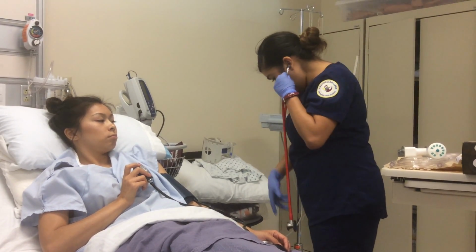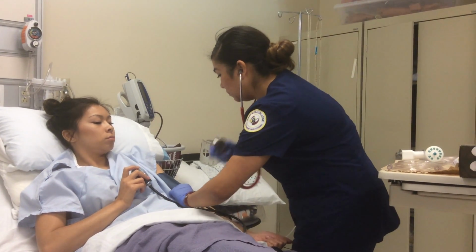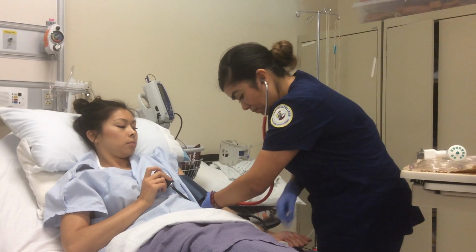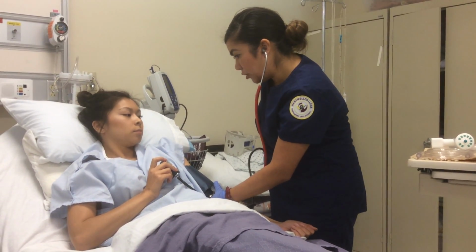And I'm going to check your vital signs again, okay? Okay, and I just want you to relax, okay? You're going to feel some tightness on your arm.